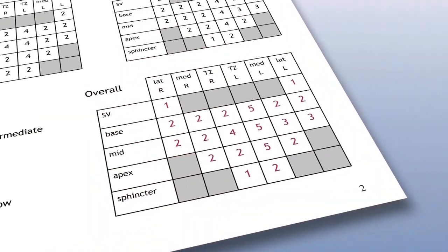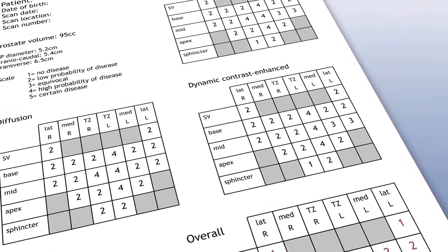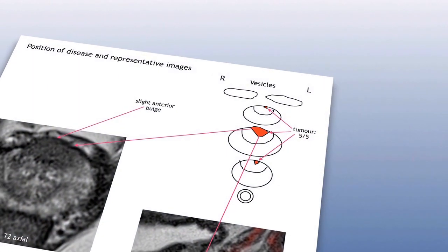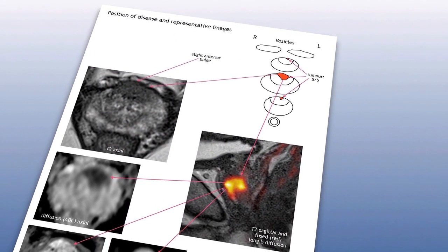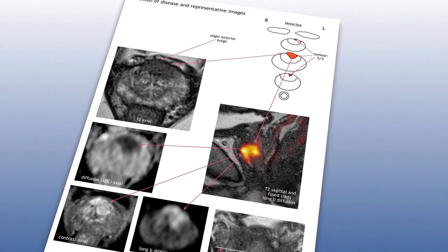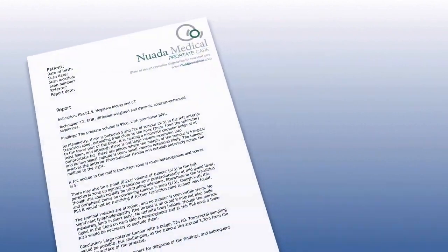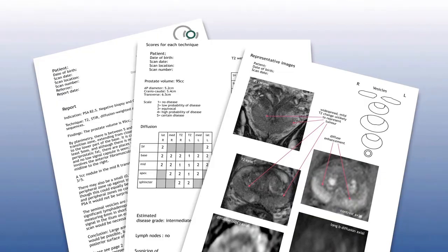What we then do is take a look at the lesions, and then we score them 1 to 5, 5 being we're certain there's cancer, 1 being that we're certain that there isn't, with the shades of grey in between. We do that not only as a diagram, but also with annotated images. MRI reports have been very helpful for me in deciding when to biopsy and when not to biopsy. I do risk stratify my patients for finding cancer, and when an MRI comes back completely negative, it makes it very reassuring for me that that patient does not have important prostate cancer.